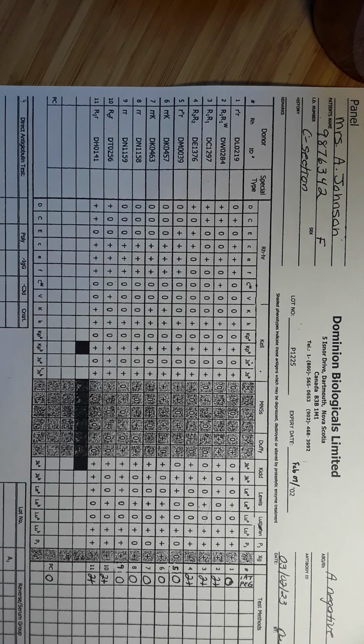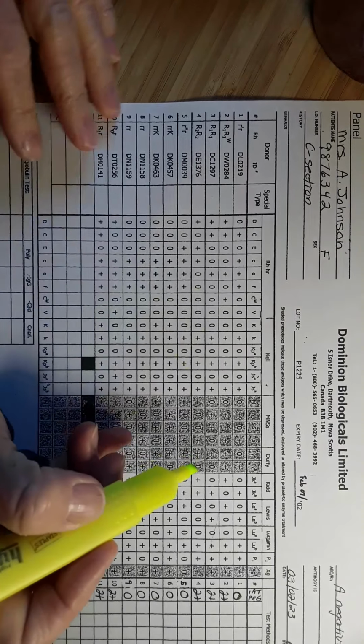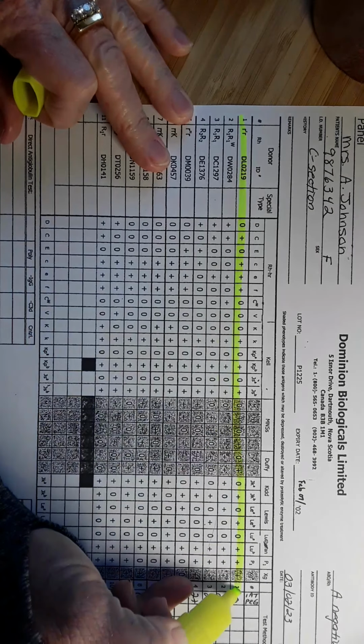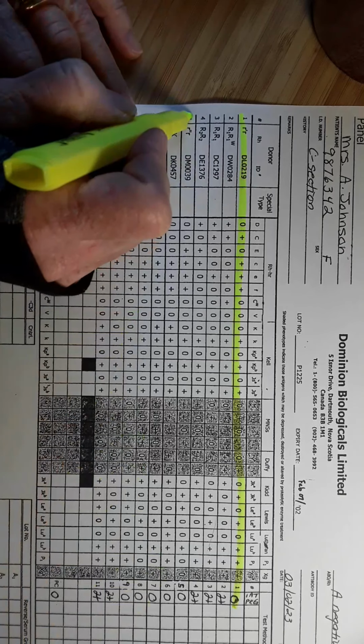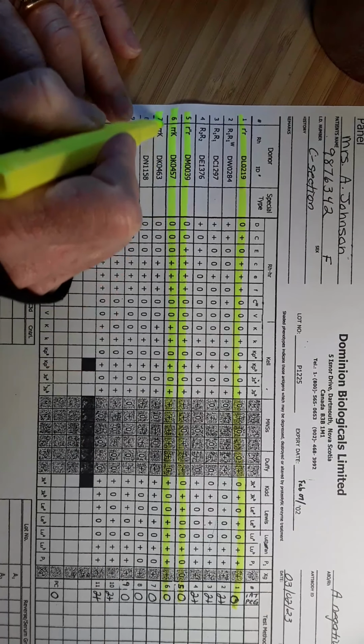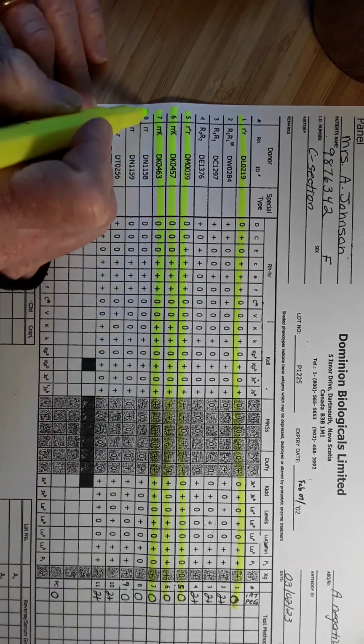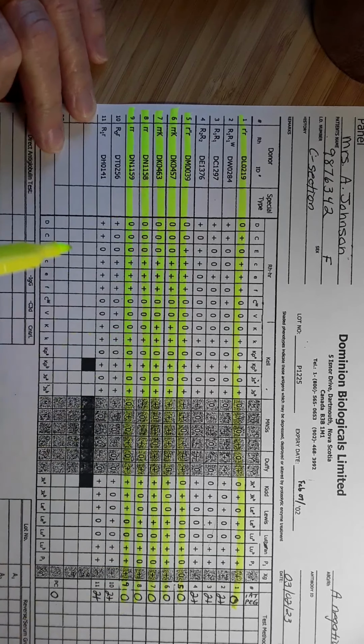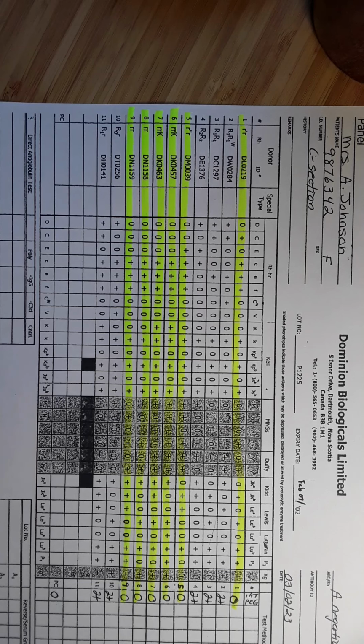Okay, so what we're going to do is highlight the negative rows. So the rows in which the patient's plasma did not react with the panel cell. So I'm going to do that. You can get out your highlighter and do that as well. So take a look over here, it's negative. So I'm going to highlight rows 1, 5, 6, 7, 8, and 9. Okay, so I hope you've done that.